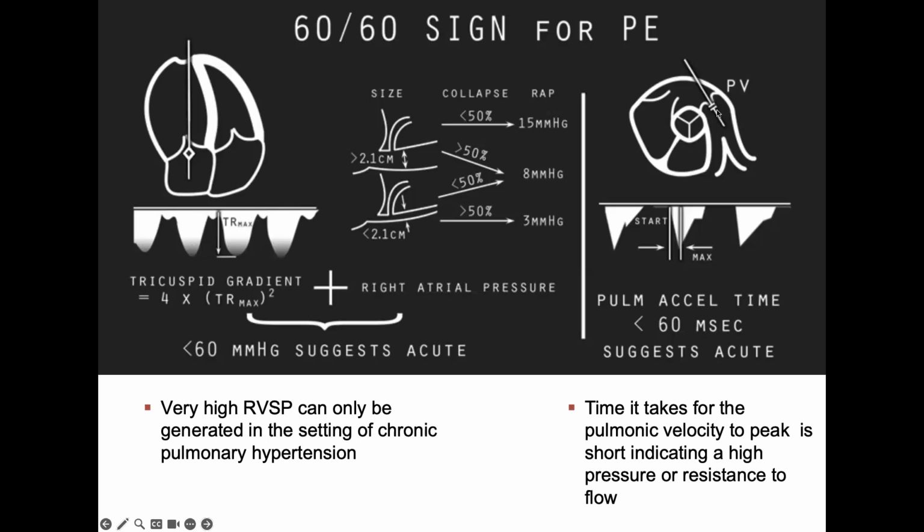You're going to put a pulse wave Doppler right here. And this would actually be a scooped out waveform if we were being totally exact. But again, this is doing velocity over time. So velocity on our y-axis, time on our x-axis. And the blood is going to be going out the PA, right? So it's going away from my transducer. Therefore, it's also a negative Doppler shift.